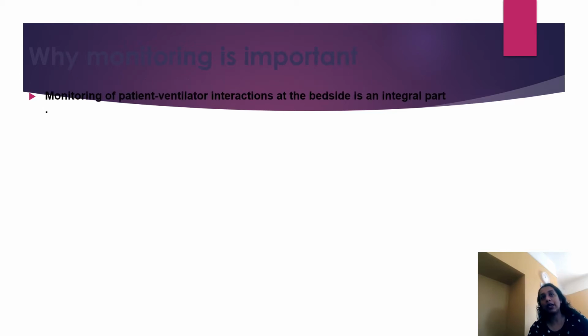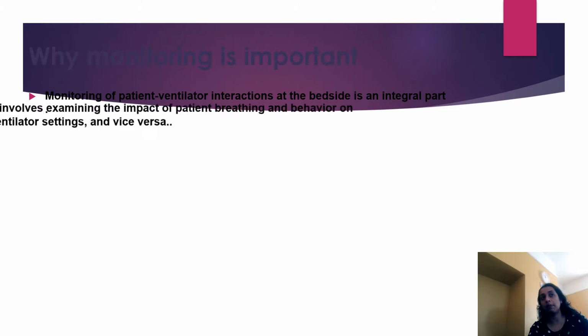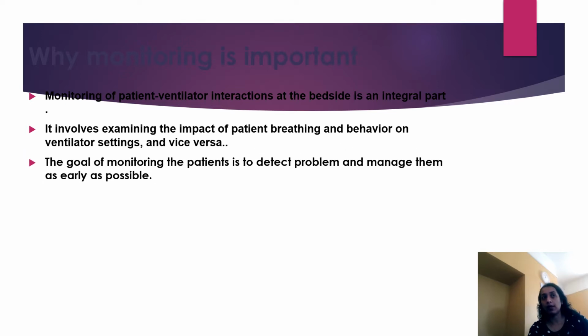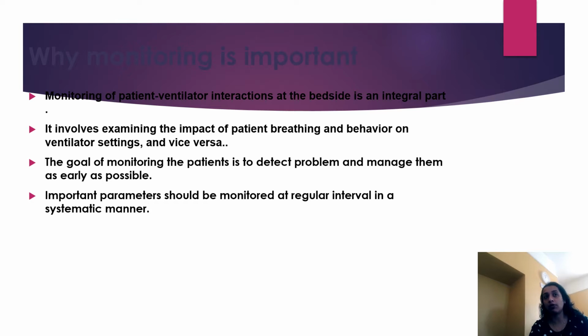Monitoring of a patient on ventilator, interactions at the bedside, is an integral part of nursing care, and it involves examining the impact of the patient's breathing and behavior on the ventilator setting, and vice versa. Also, the goal of monitoring is detecting the problem and managing it as early as possible. As we say, prevention is better than cure. So we have to prevent the patient from going into further critical complications through early detection of the problem. That is always through monitoring the patient or assessing the patient properly, especially when they are on the ventilator.